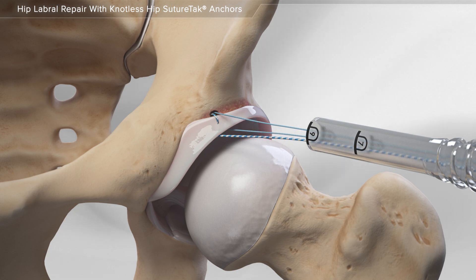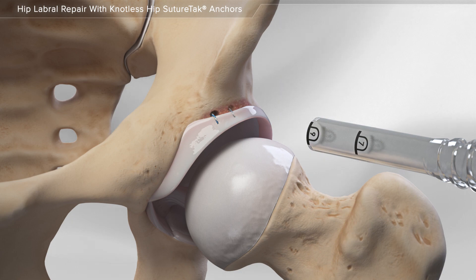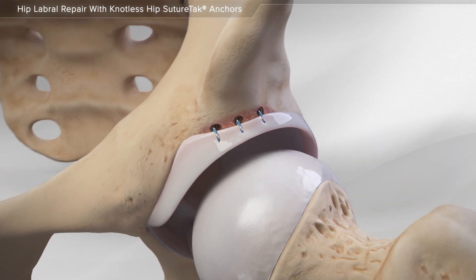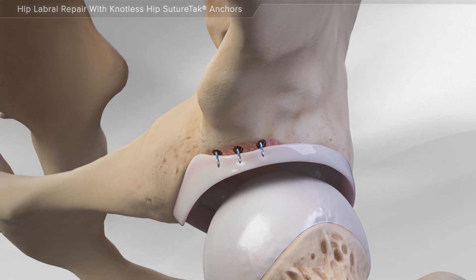Finally, the suture is passed back through the anchor and tightened. Your surgeon may choose to repeat this step with more anchors if the tear is large. This completes the repair of a damaged labrum in the hip.